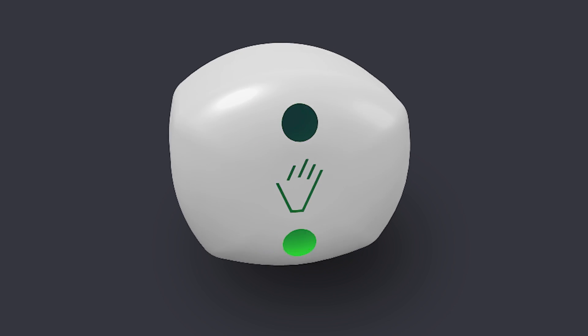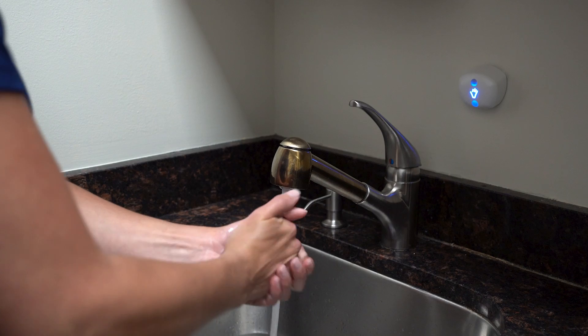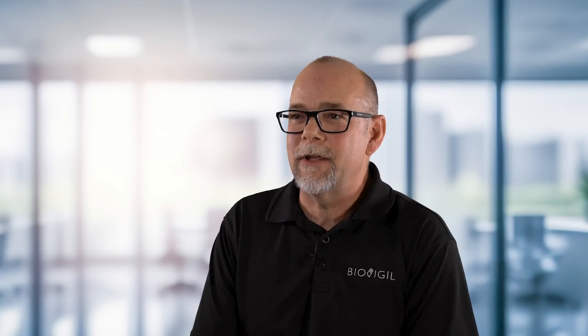I'm really proud of our team at BioVigil for developing the AccuWash technology, a new and innovative solution for recording and representing sink hygiene within healthcare and other environments.